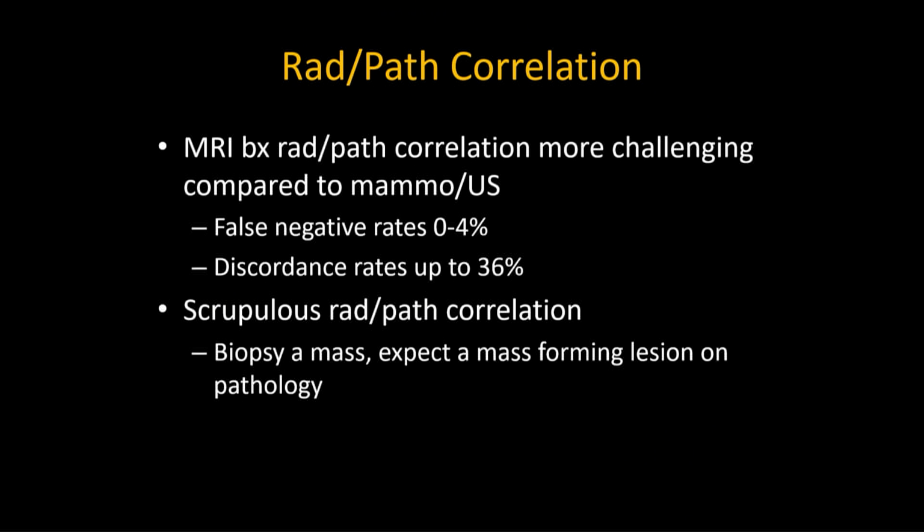So why is this more challenging compared to mammo and ultrasound? I always say on mammo and ultrasound, you know what your finding is.